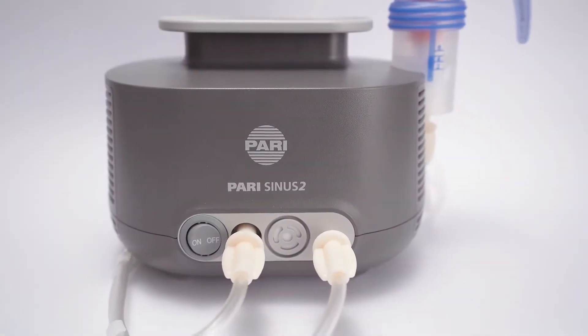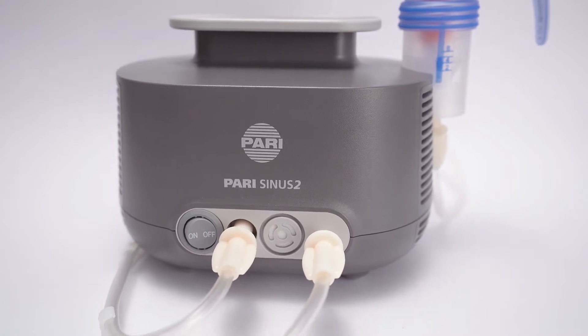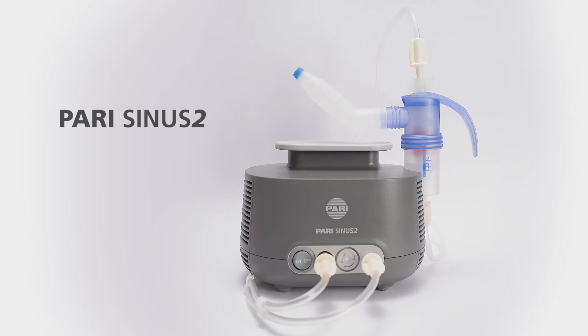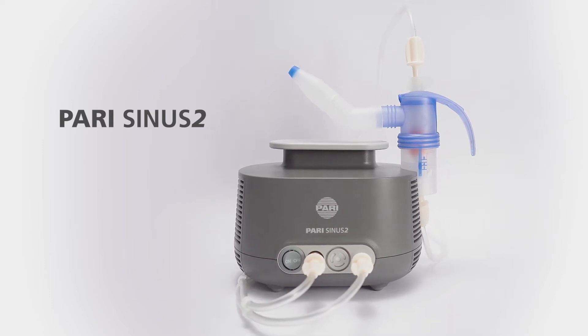PARI Sinus 2 is a nebulizer system for the treatment of sinusitis. It's suitable for use by children aged 6 and over, as well as by adults.